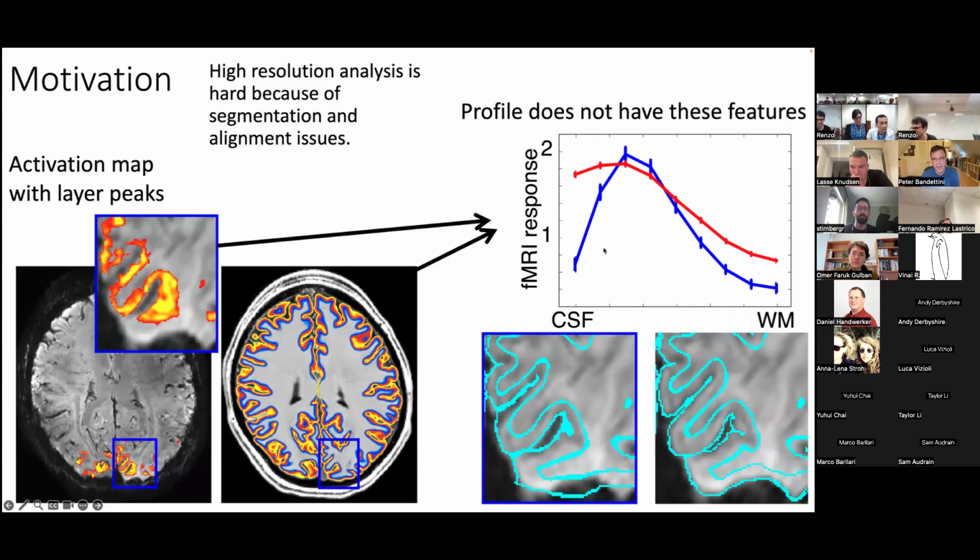I had a couple of small comments and questions. One thing that's maybe not worth mentioning, but even as far back as the 90s, MGH knew that they had a T1 weighted scan that had the same readout window length as their structurals, and that's what they used all the time.